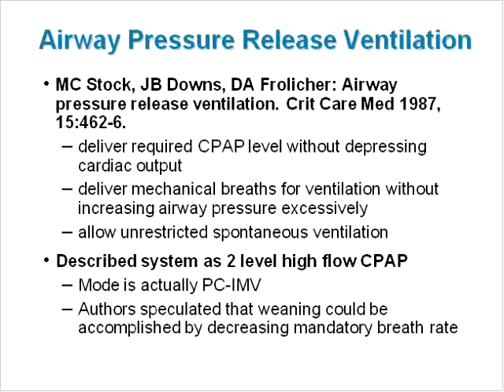Airway pressure release ventilation was first described over 20 years ago. The primary goals of this mode were to provide both safety and comfort. Safety in that adequate ventilatory support still had to be provided without depressing cardiac output, and comfort in that unrestricted spontaneous breathing would be allowed, which was unavailable in conventional modes of that period. To do this, the authors had to build their own ventilator.